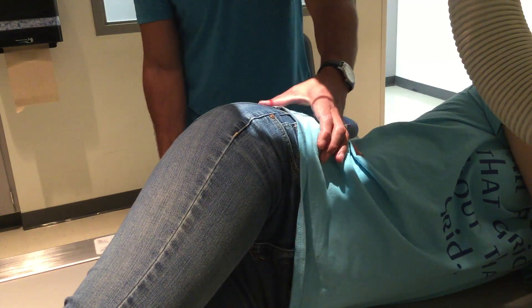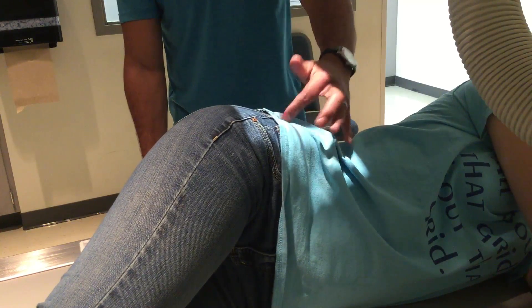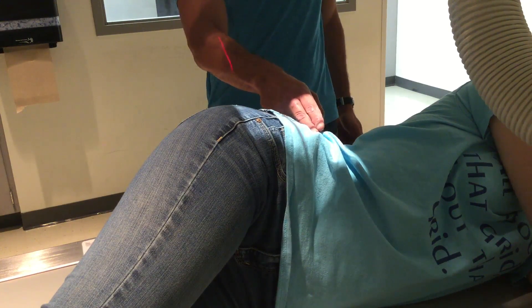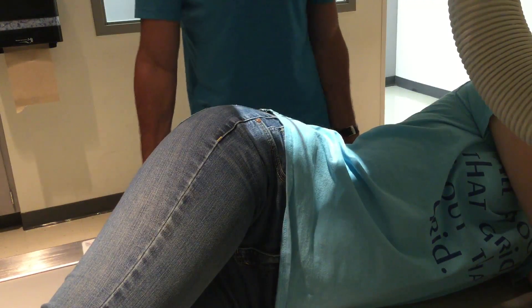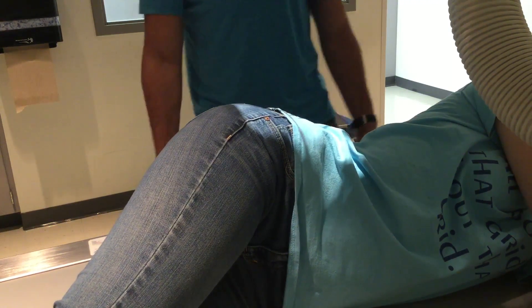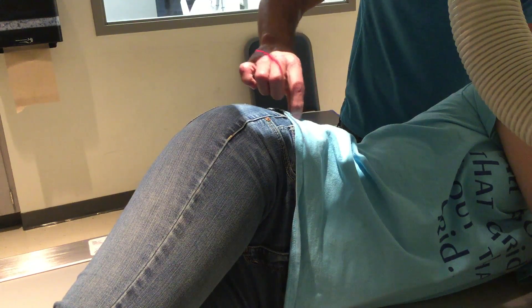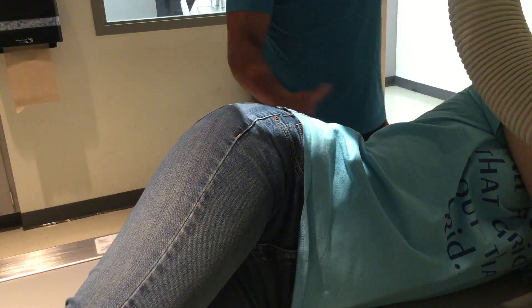ASIS is higher. Posterior, three inches down — right about there. You can imagine: if this is L4, then L5 is here, which means your sacrum starts here and begins to curve this way, and the coccyx comes down here. So you may even be able to use that as your estimate and then visualize — look at L4, L5, and the sacrum curving around to the coccyx. You definitely want to include them both. The way the book tells you to do it is a little off, so just look and confirm you have the tailbone. That's approximately it — it's a good starting point.